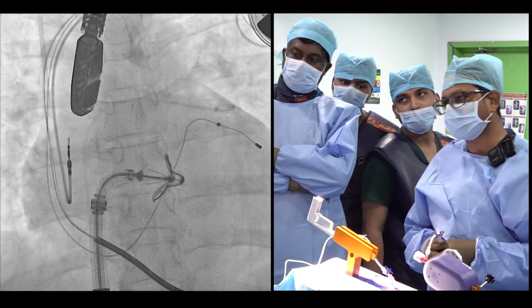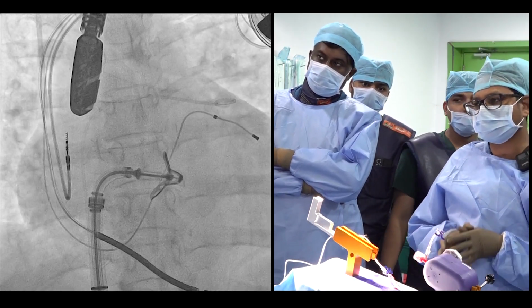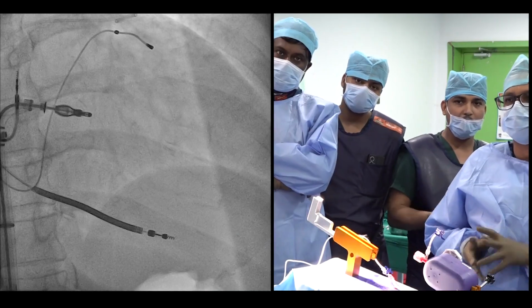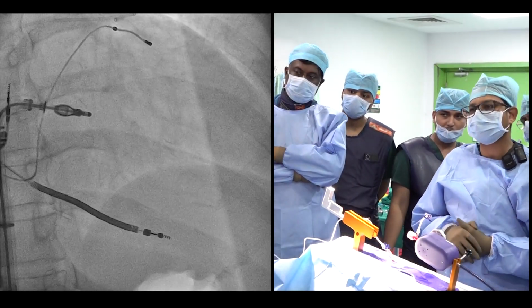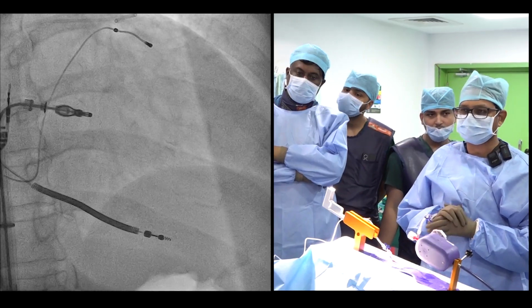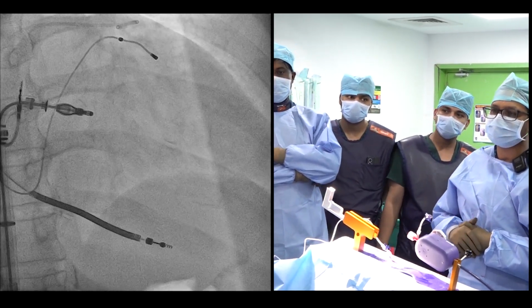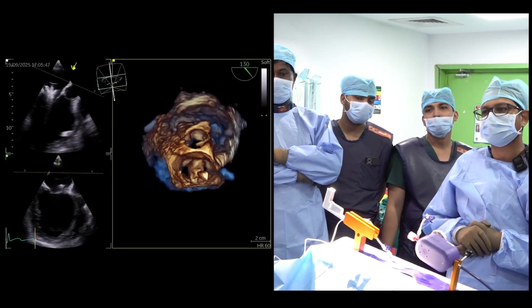We open the arms to 120 degrees and analyze whether the position of the MyClip is optimal or not. The optimal position in this case is around 12 o'clock to 6 o'clock. By manipulating the delivery system, the MyClip delivery catheter, we take it anterior, posterior, as well as medial and lateral. We position the MyClip into the 12 and 6 o'clock position. You can appreciate that our MyClip is at the 12 and 6 o'clock position.